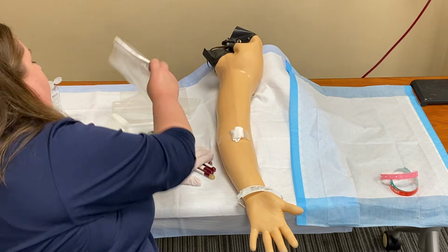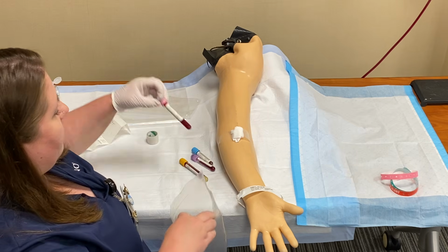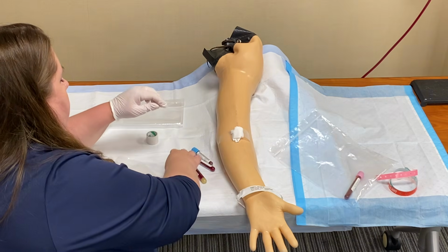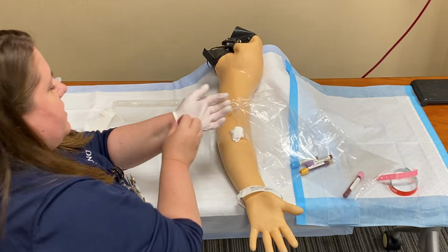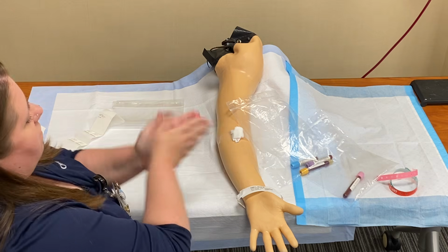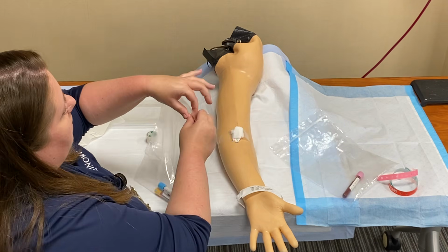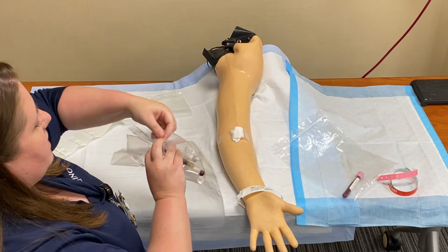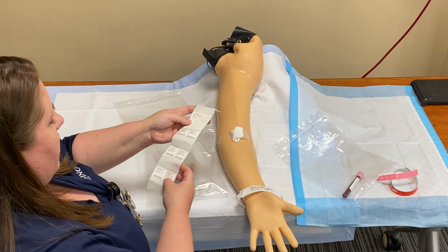I'm then going to grab a bag, and I'm at Fairfax, so I'm going to put my pink tube in one bag. I'm going to grab another bag to put my other tubes in. Take off my glove, wash my hands. I'm going to seal up these bags, roll it up, put it inside a second bag, and then I want to make sure that my extra labels go with it.